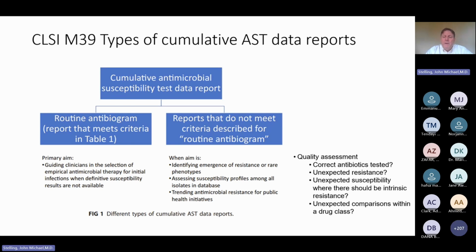resistant strains. So if I see 1,000 E. coli with 1,000 ampicillin, 1,000 gentamicin, but only 100 amikacin, I would not be very surprised if the amikacin resistance was higher, because they only tested it in the somewhat resistant strains. This is what we call testing bias. I'll talk about that in a few additional slides. Throughout this presentation, I will come back often to this concept about bias.